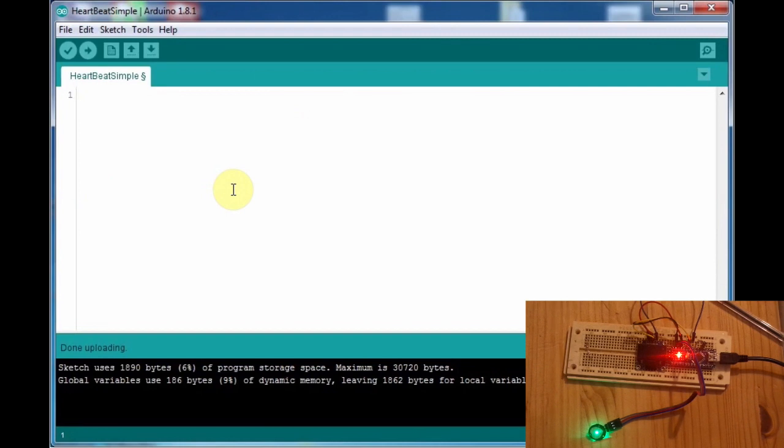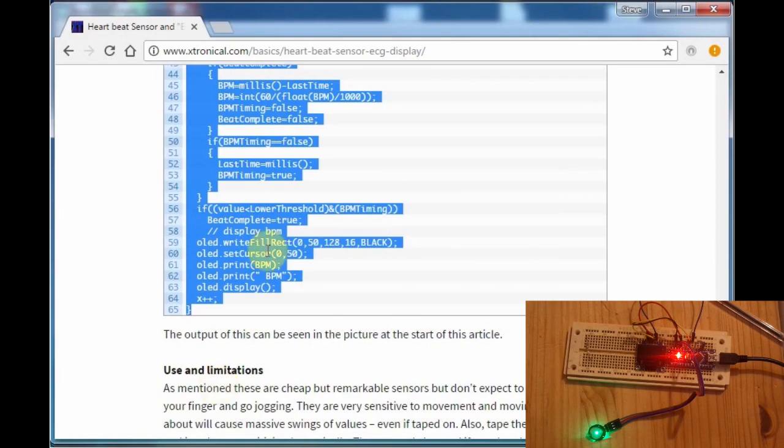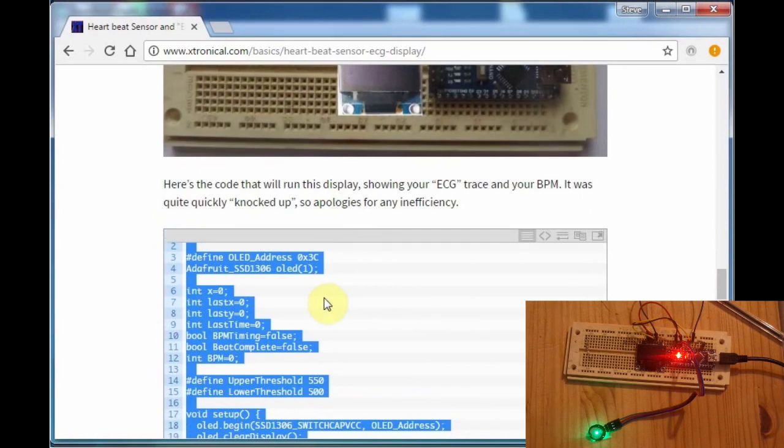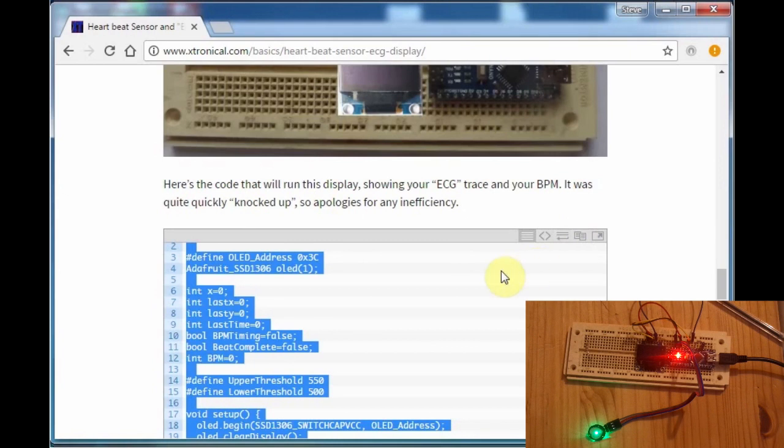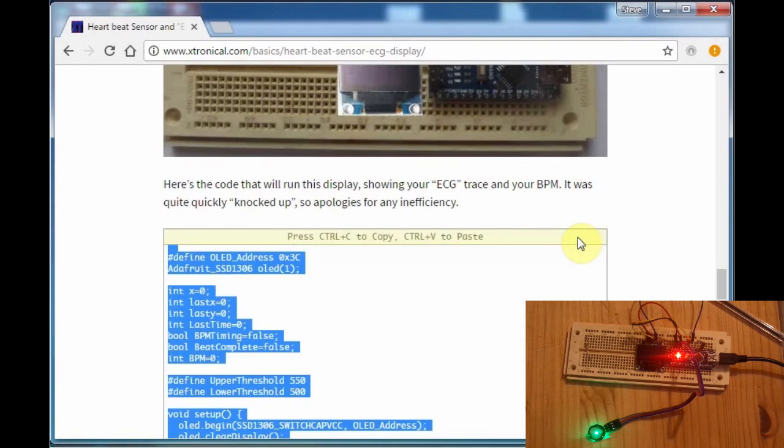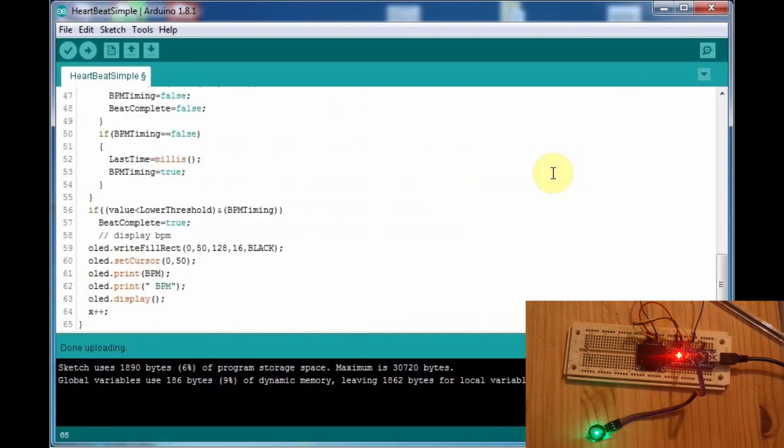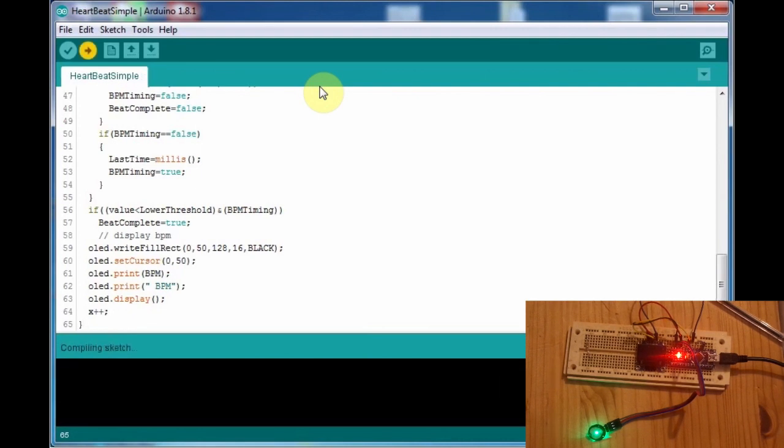So we'll just copy. Control C. Get rid of that. And we'll just select all and delete it all. And just paste in the code that we've just done. You have to click there. So when you've highlighted it, rather than control C, it doesn't work. You've got to go there. Copy it. So Control C to copy. Now you can do control C. And then we'll paste it into that code. There we go. I will upload that. And we should see the display come to life with a trace coming along the bottom. Nearly finished compiling. Uploading.